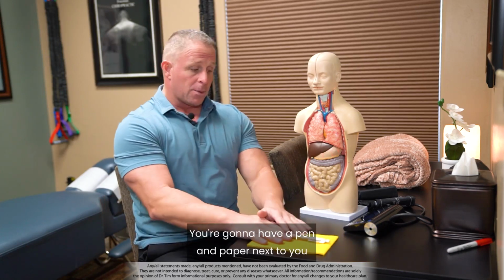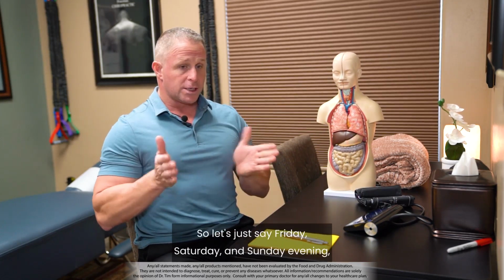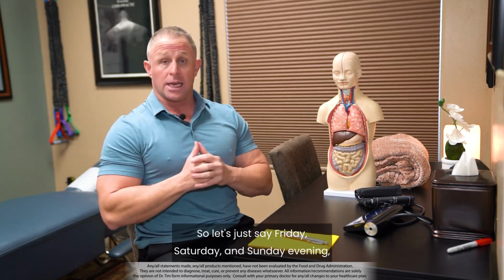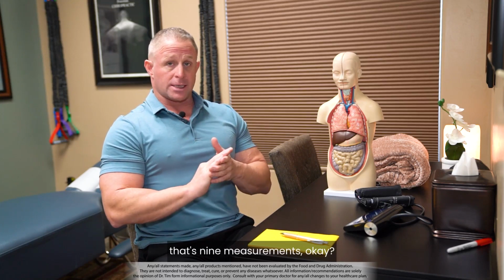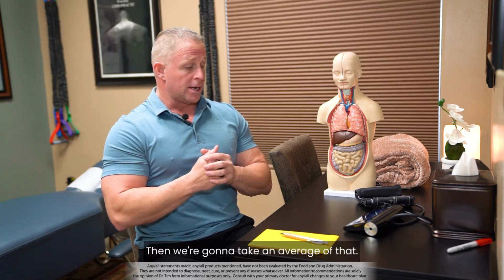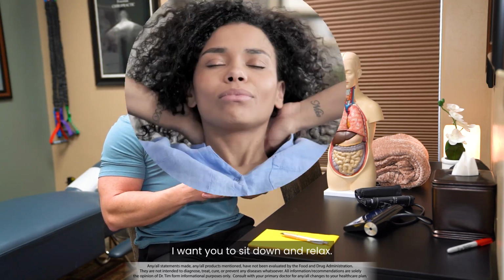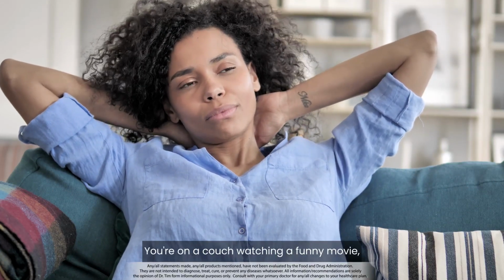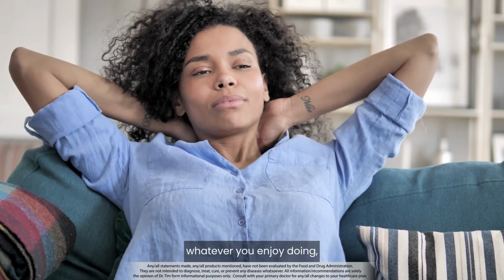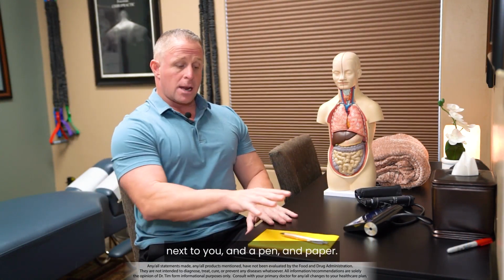You're gonna have a pen and paper next to you, and basically, you're gonna pick 3 evenings. So let's just say Friday, Saturday, and Sunday evening. 3 days, 3 different measurements per day. That's 9 measurements, okay? Then we're gonna take an average of that. So when you sit down, let's say Friday night, and you start taking these measurements, I want you to sit down and relax. You're on a couch watching a funny movie, or you're doing crossword puzzles, whatever you enjoy doing, but away from your busy day, when you're kind of relaxed in the evening, and you're gonna have your blood pressure cuff next to you and a pen and paper.